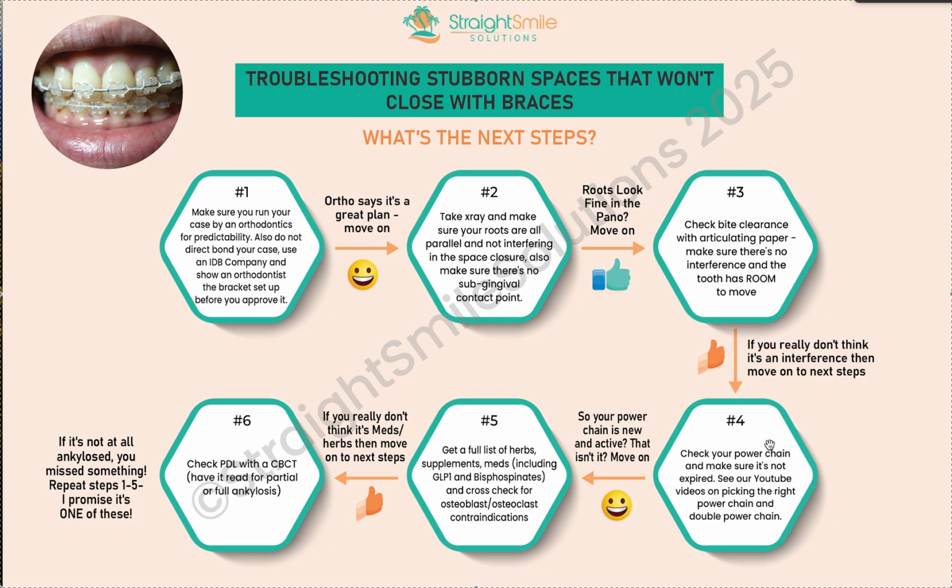Depending on the size of the teeth, you may need short, you may need continuous. We only purchase, to be honest, the continuous because you can just leave extra links and it's just so much less waste than having 30 different colors in short, 30 different colors in continuous, 30 different colors in open. I mean, that's dumb. That's 90 things you got to buy each year. Why not just buy one set of continuous in all the colors once a year instead of all the different formats? Just leave extra links if needed. It's just so much easier.